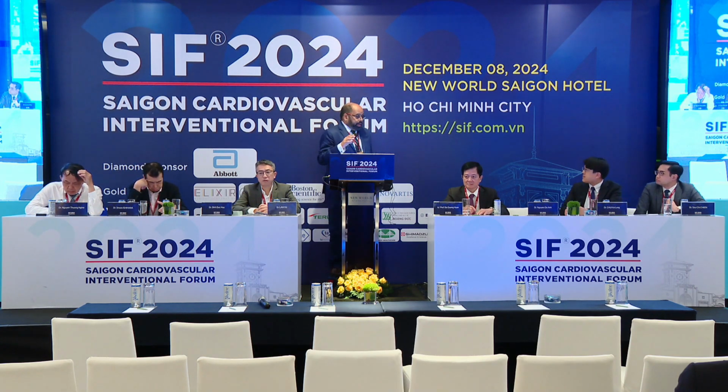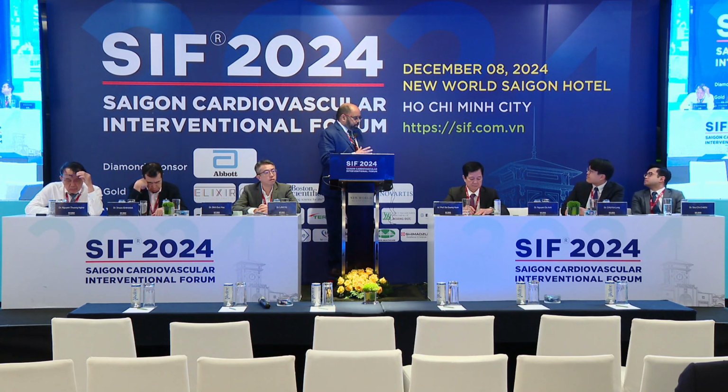So almost every case. So generally, 90% of my PCI is done with imaging, and it's mostly OCT. So I don't make a difference whether it's stent. I start every case as if it's going to be a DCB case. So I do about 60–70% of my cases with DCB. So every case is done with imaging, pre-PCI.